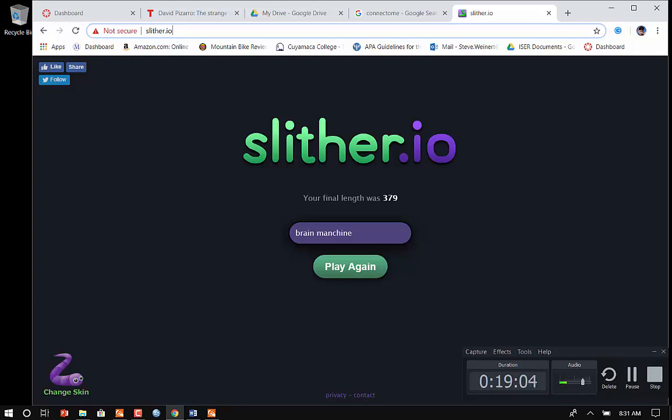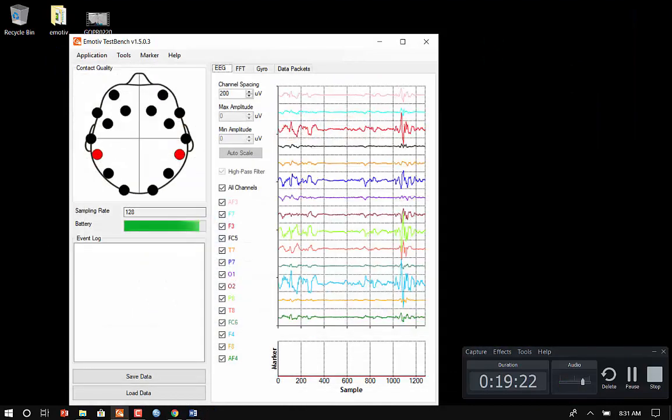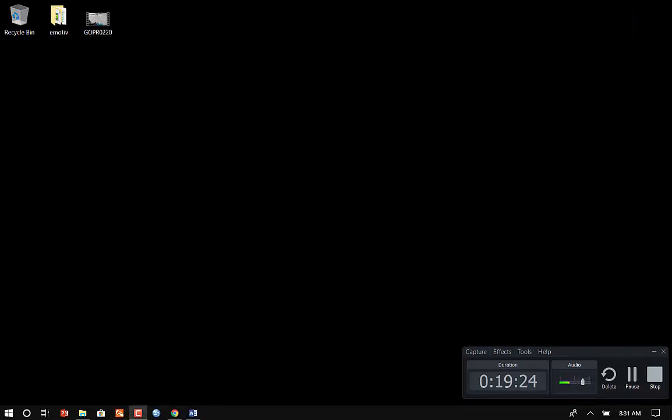Did you ask him afterwards? Yeah. So when we put his brain up there, oh, do I have him saved? I might be able to find. Yeah, I did record it, but I didn't record it as it was going. Okay, but what I did is, remember his brain waves started putting those even spikes when he closed his eyes.